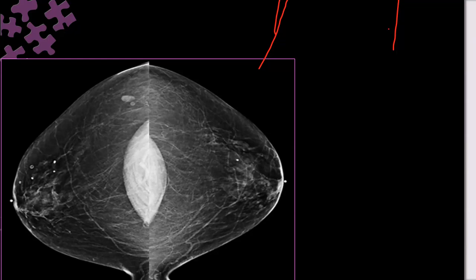For the posterior, you have three criteria to evaluate. If you have seen the pectoralis, central, and the nipple in profile and central, you will accept it. Khalas, that means this is adequate. That ensures you have seen the whole posterior breast. If you did not see it, you look for retromammary fat. Otherwise, you go for the posterior nipple line.